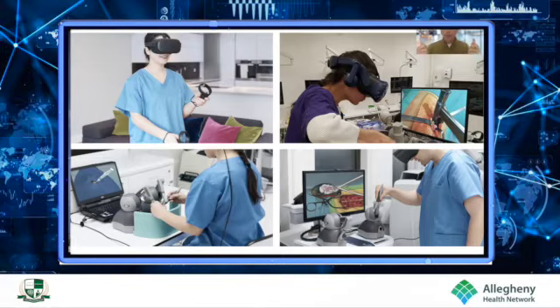Now, haptics, top left, you'll see those gaming controllers that come with a VR controller. They buzz, they vibrate. That's a basic haptic interaction. It tells you, kind of binary, good, bad, off, on. Across the bottom, you're seeing a much more sophisticated haptic, a kinesthetic haptic, which can replicate the weight, the heft, the resistance, the force feedback of surgical interaction, replicating the real world, where you can start to build up muscle memory. And that's the big difference between those two areas.